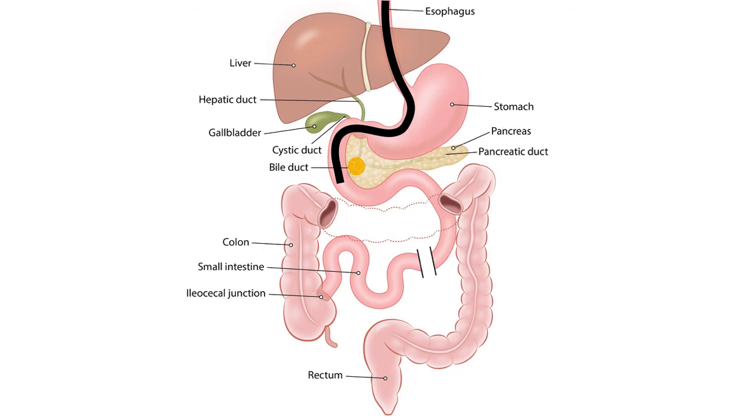the bile duct. Here we want to get into the bile duct, so you pass a catheter up the bile duct and then inject dye so that you can see what is happening with the bile ducts under X-ray control or fluoroscopy control. So, the dye goes up, you can see that under X-ray control.